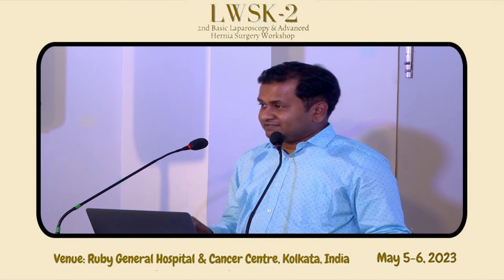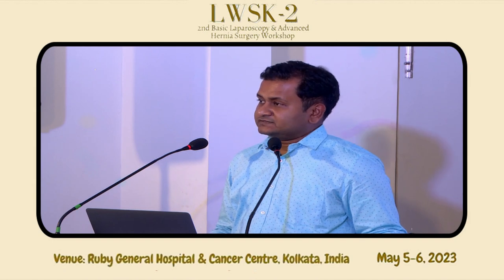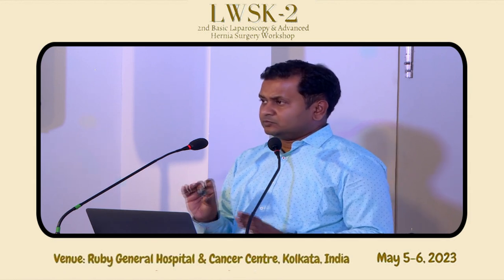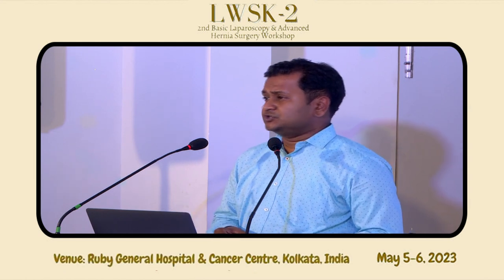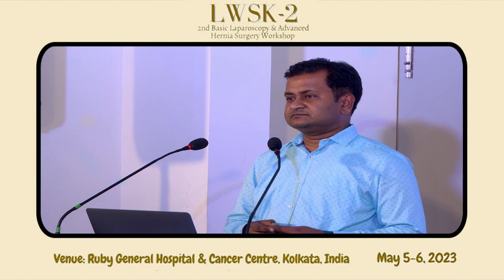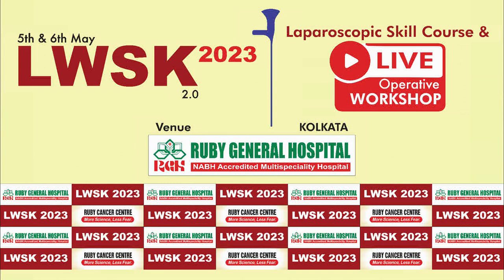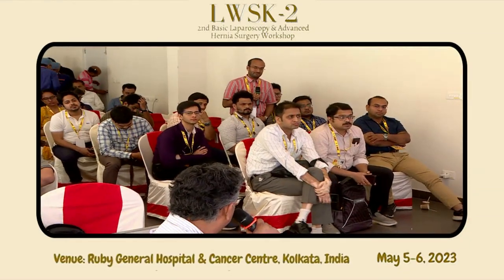But if you find it difficult, then it is better to go ahead with the open trocar technique. You go layer by layer, identify the peritoneum, make a small nick, then under vision you put the port. That is more advisable if the bowel is too dilated or if you are not sure where to put the first port. And to bookend this discussion about diagnostic laparoscopy, don't forget this entity called mesenteric ischemia, because it gives very difficult clinical signs. A scope is invaluable there to see the color of the bowel and then decide.